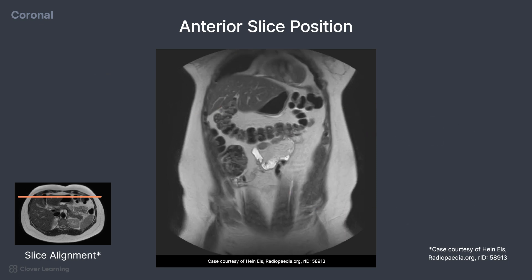Continuing posterior, towards the top of the image, you can see dark areas where the lungs are filled with air. Just inferior to the lungs is the diaphragm, with the liver located just inferior.